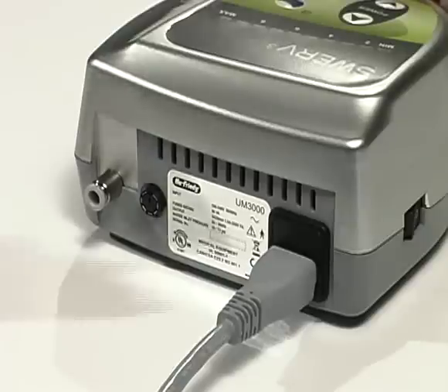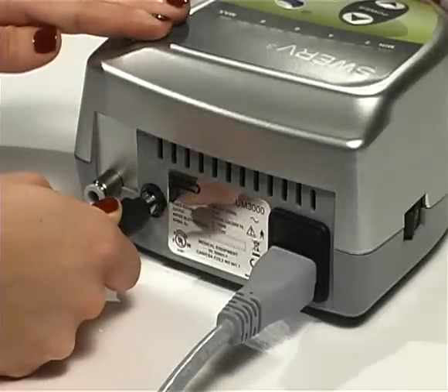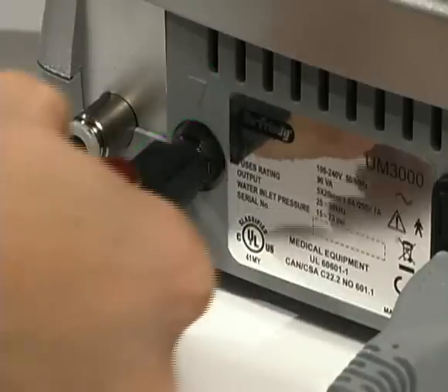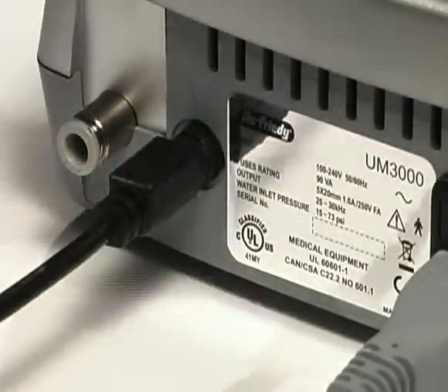Connect the foot control plug to the foot control connector at the back of the control unit. Take care to properly align all the pins. Push the plug gently into the connector.